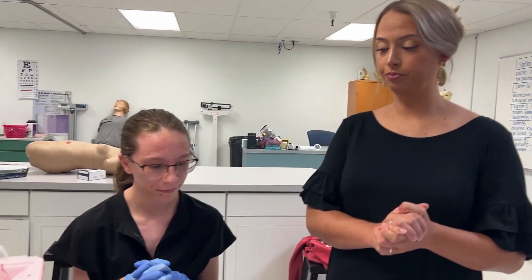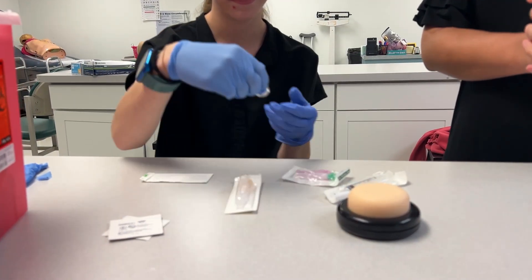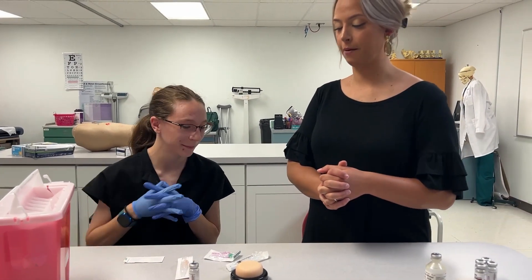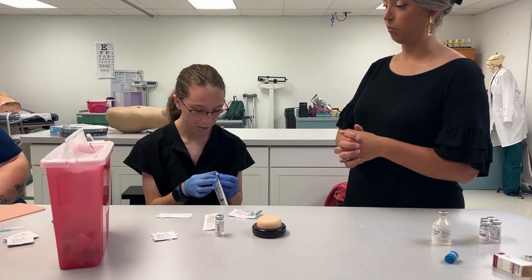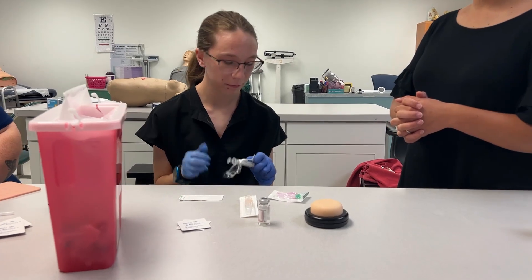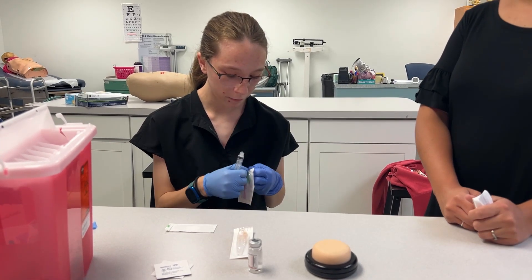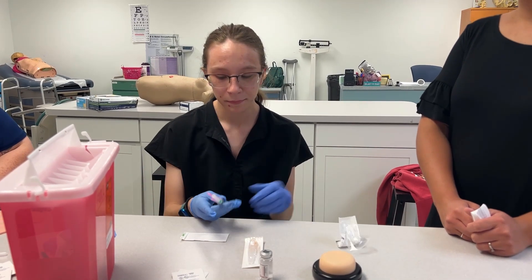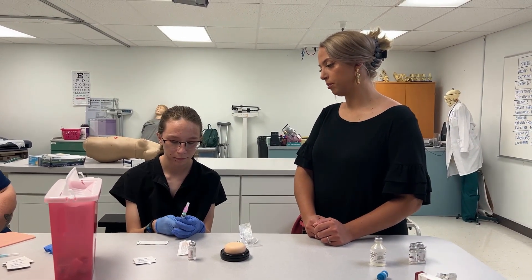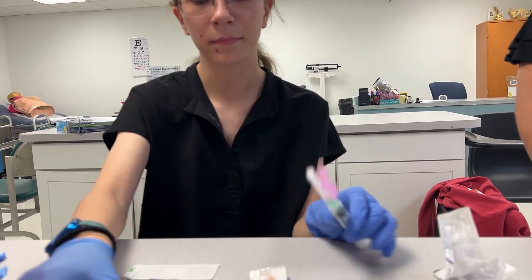First thing she's going to do is get her equipment together and make sure she has her medicine. Go ahead and grab your medicine. Get your syringe and put your draw-up needle on it. Pull back to one ml, and since we have a vial that's already open, we're going to wipe off the top with an alcohol swab.